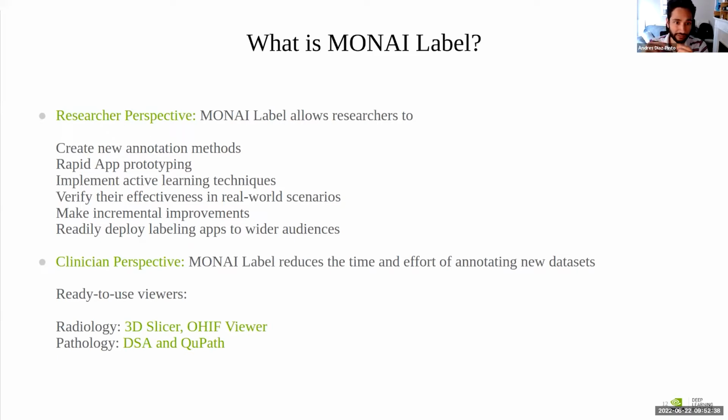And MONAI is based in PyTorch. So everyone that knows PyTorch should be able to work on MONAI and then MONAI Label. So that's the research perspective. We have that platform for the users to work on that. From the clinician perspective, he or she wants to reduce the time and effort spent on annotating new data sets, right? And for those users, we developed the 3D Slicer module and the OHIF module, or the OHIF plugin, for them to annotate the data sets, right? So we still have a lot of things to do to facilitate that, but that's the ultimate goal. That's the persona that we are also aiming for, right?